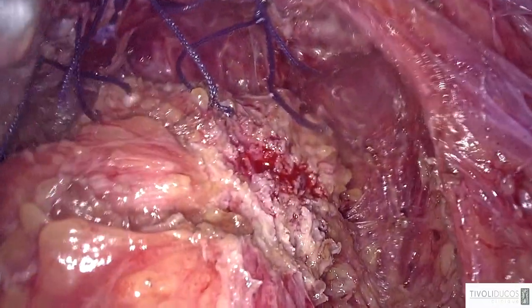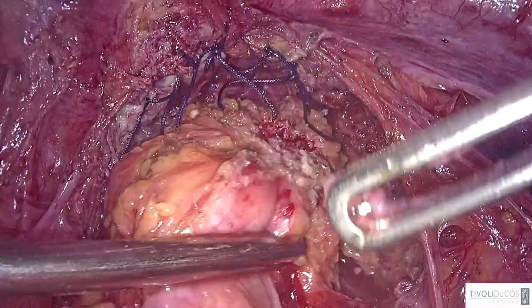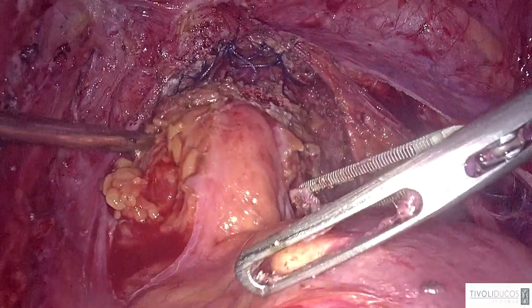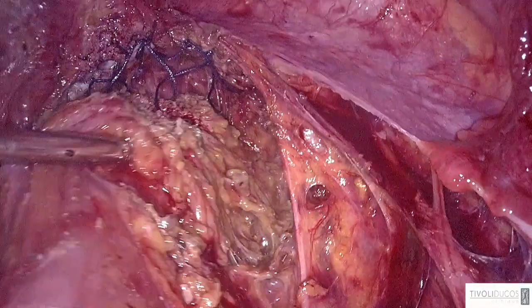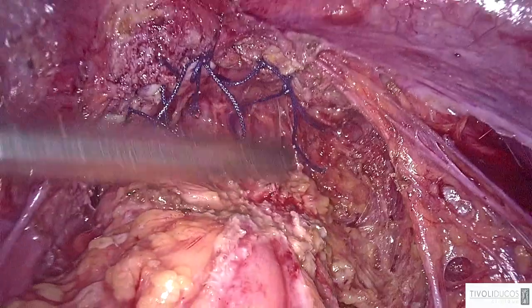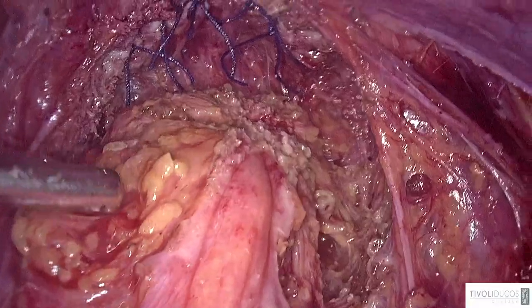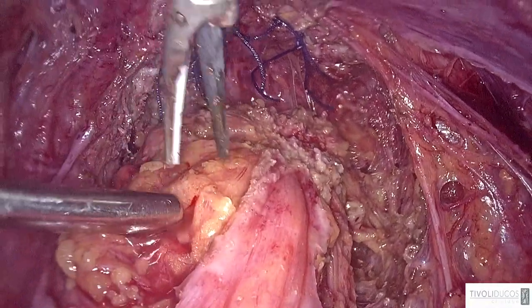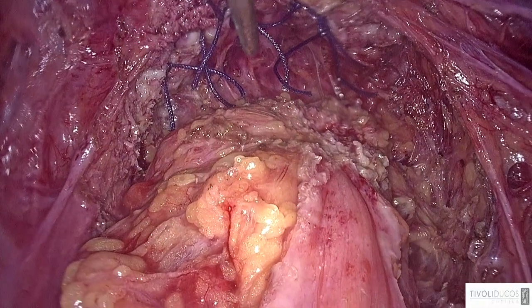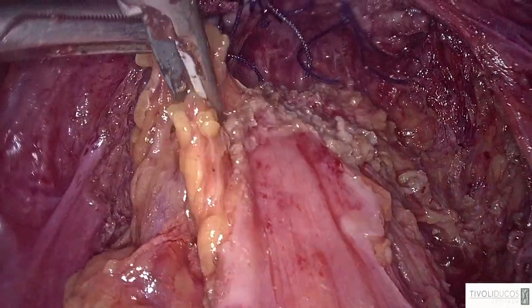So I will take the scalpel in a hand, and I will put it like this, my friend. Jamil, you have to put it like this. So this is the infiltration, you see. It's very thick. Hold it. And now I will take a grasp and I will remove all the fat tissue on contact with the rectal wall. And once I finish, I will call my colorectal surgeon.